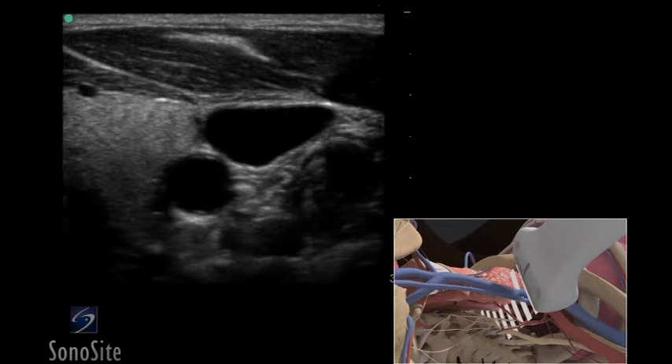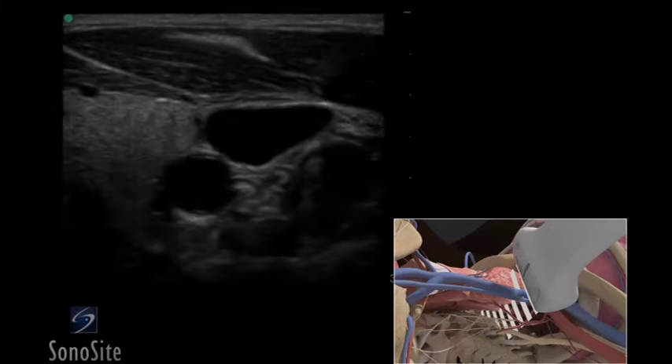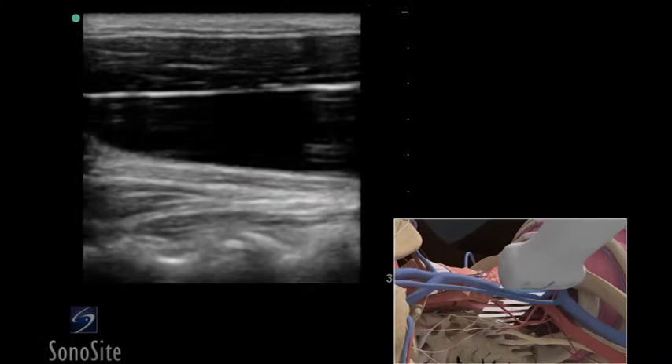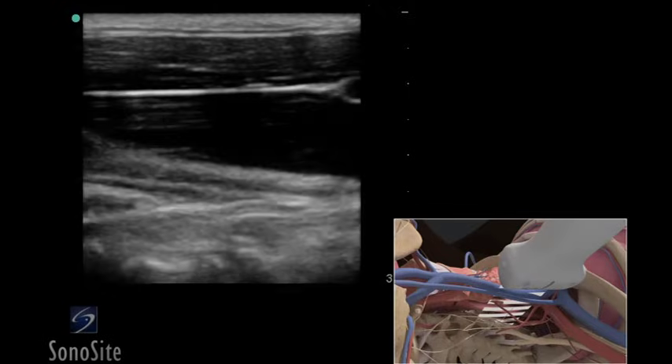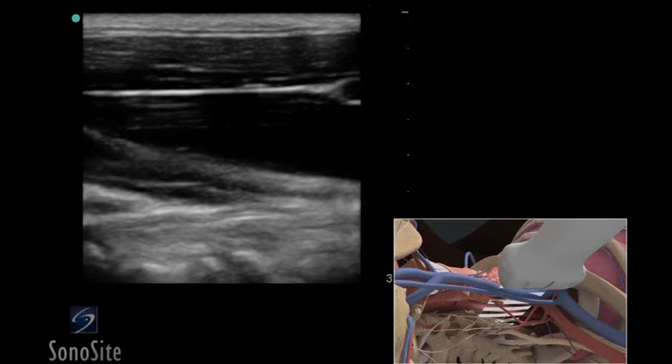To obtain a long axis view of the vessel, center the jugular vein in the image and turn the transducer 90 degrees so the orientation marker is directed toward the patient's head. In the ultrasound image, the internal jugular vein will appear superficial to the carotid artery.